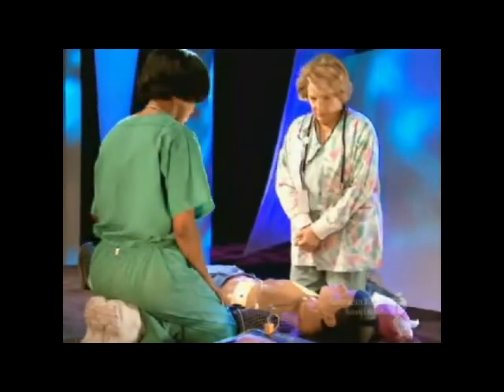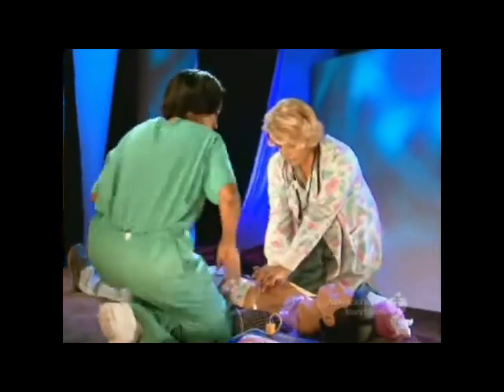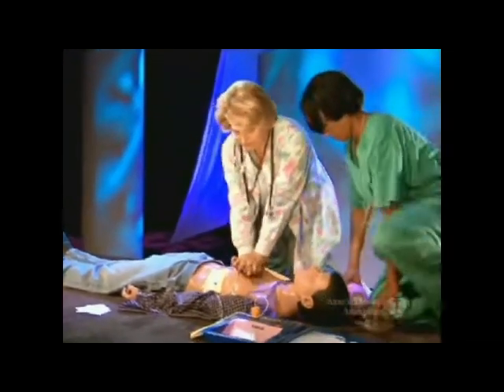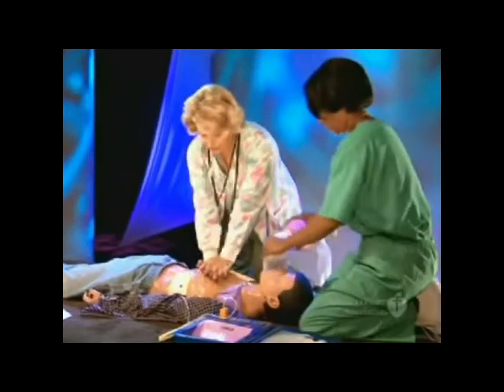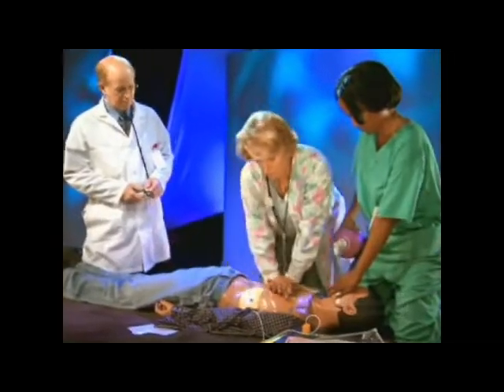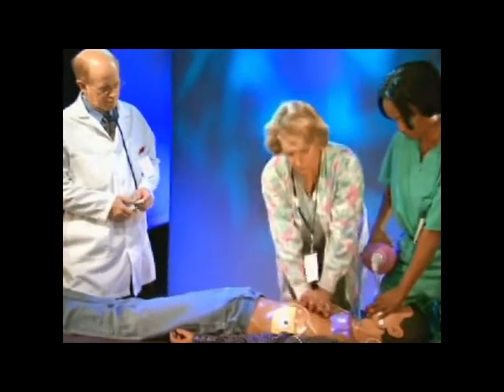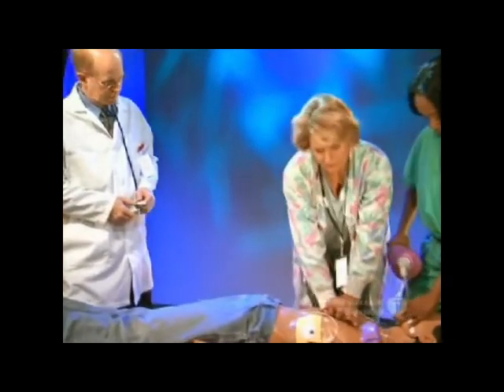No shock advised. Begin CPR. Repeat this sequence of CPR and AED use until advanced life support providers take over or the victim starts to move. So, now you know how to use an AED with 2 rescuer CPR. CPR is performed slightly different when a victim has an advanced airway, such as an endotracheal tube, combi tube, or laryngeal mask airway in place.